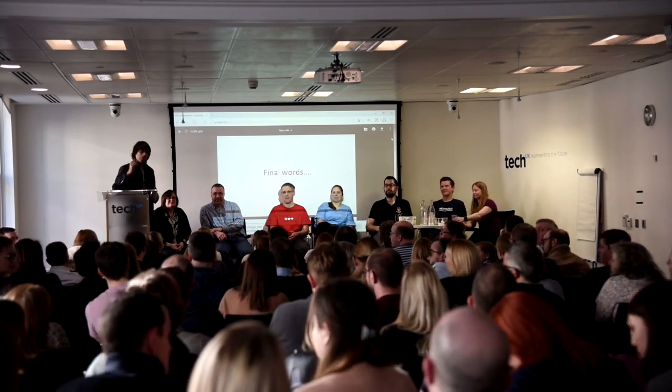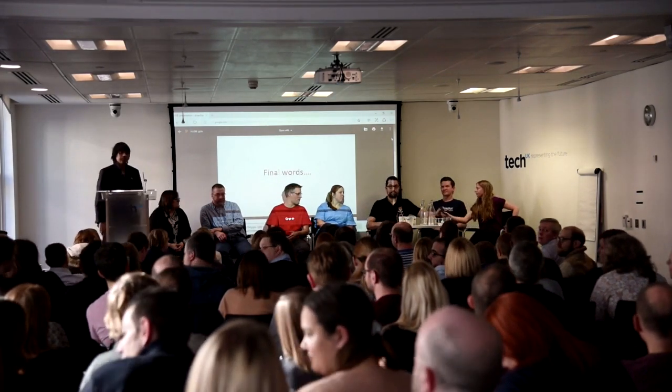Question for Dana. So you said 6 months without manual bolus. Does that literally mean you'll eat a sandwich, a burger, and you don't have to do anything? I will do carb entry via my watch or my phone, but no bolus. And it's a very non-precise carb count. I do like 30, 60 carbs, whatever. I make sure that it's communicated to my rig, and that's all I have to do.